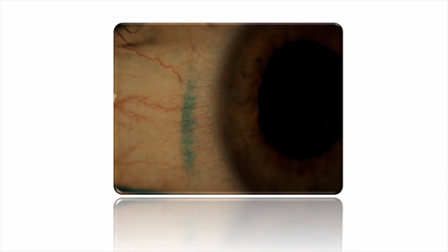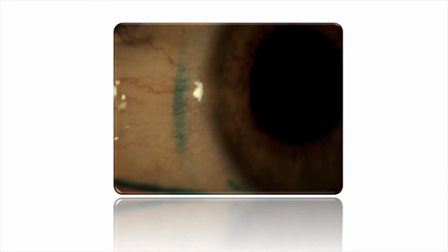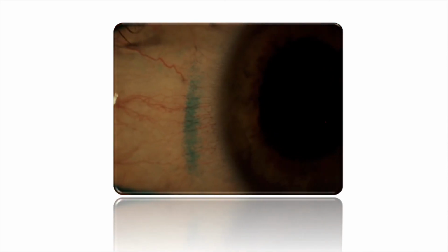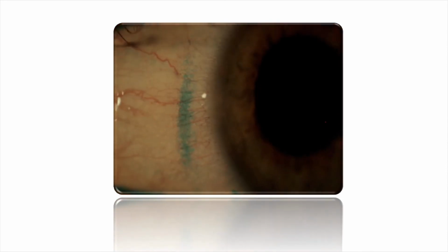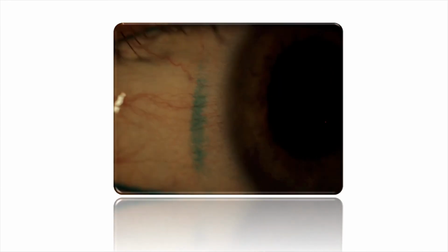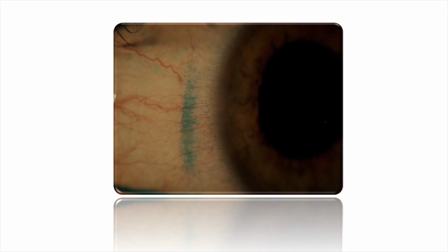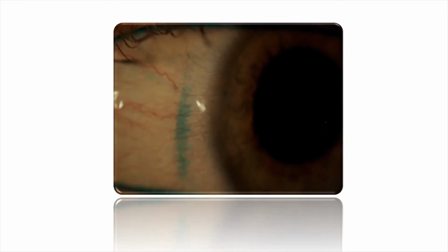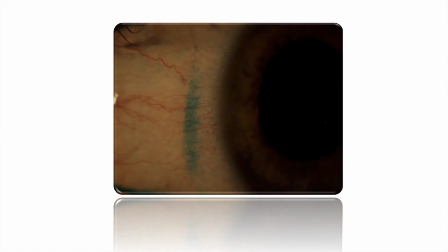This would be the type of patients that we're going to move in our practices into another type of lens or possibly switch their solution, even though they're not reporting any problems. It's our clinical opinion that if left untreated, this type of problem may become more symptomatic for the patient, and thus we like to take a more proactive approach.